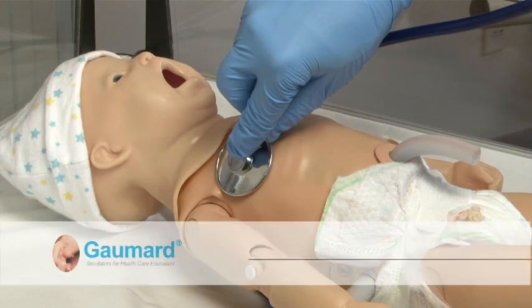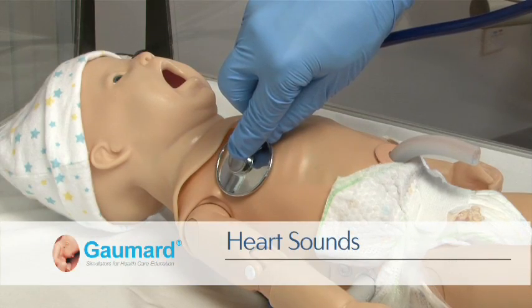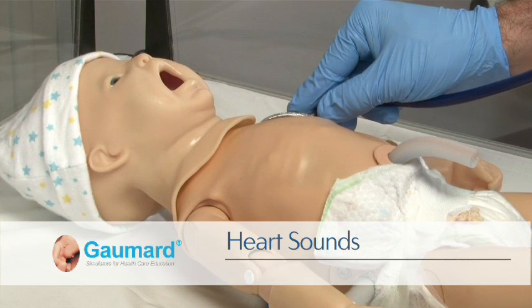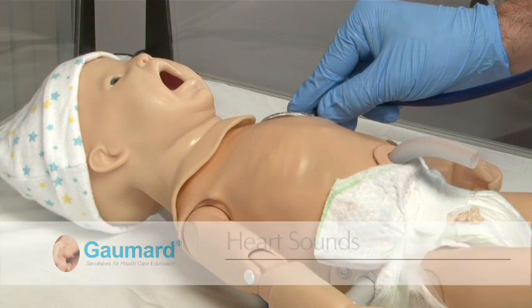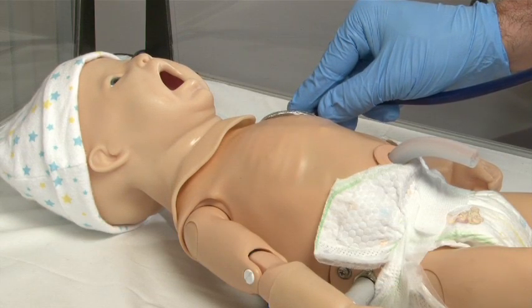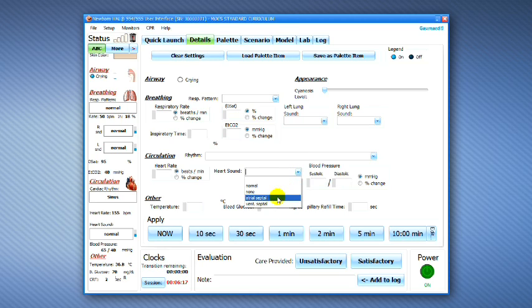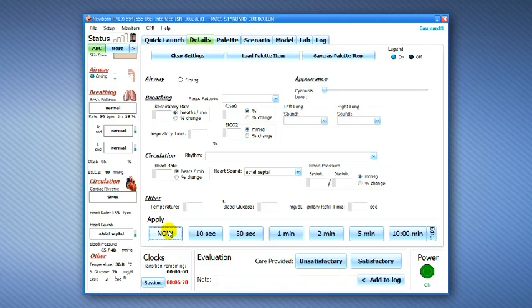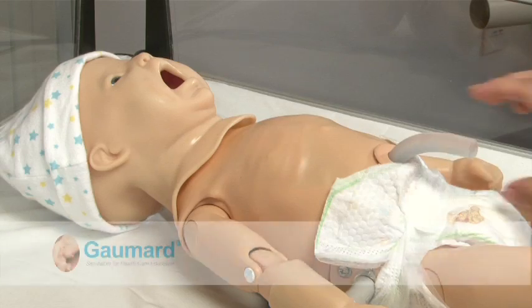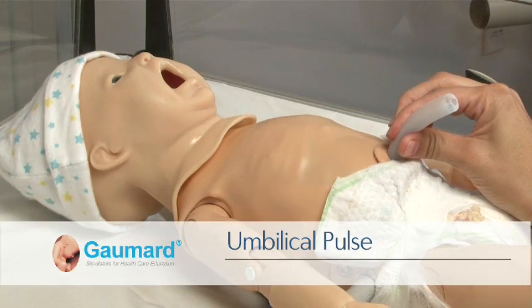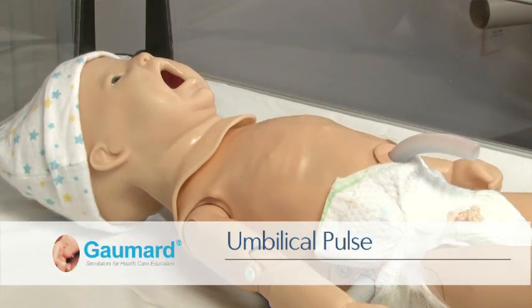Newborn is equipped with several realistic heart sounds, which are synchronized with software-controlled heart rates and rhythms. Newborn also features a palpable, blood pressure-dependent umbilical pulse.